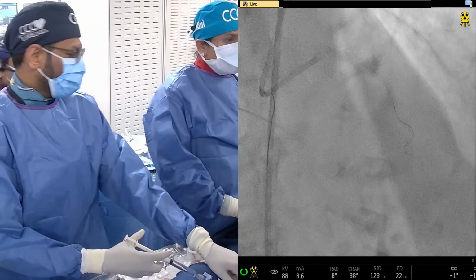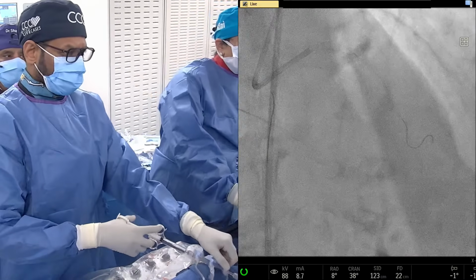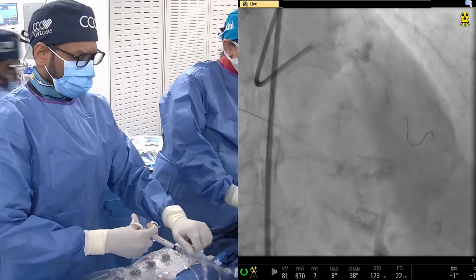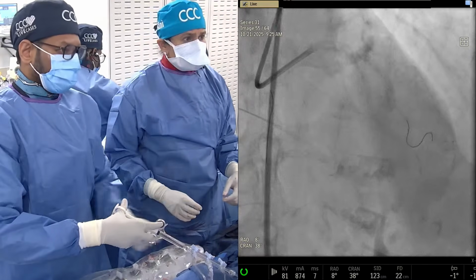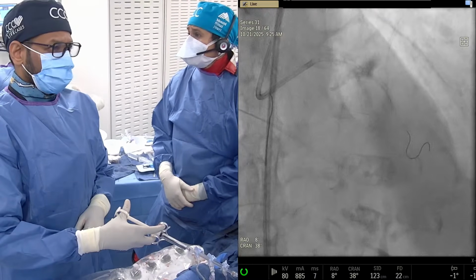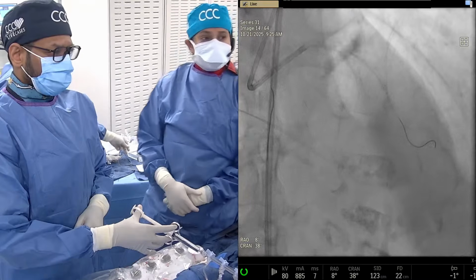The area of the diag is not fully expanded. Question is, do we go with 2.75 or leave it? Distal edge of the LAD looks okay? We didn't check. Huh? We didn't do IVUS. Distal edge of the LAD with the first run. That's the diag. No, we did the LAD. Okay, I'll show you the picture. The LAD had not been done yet.